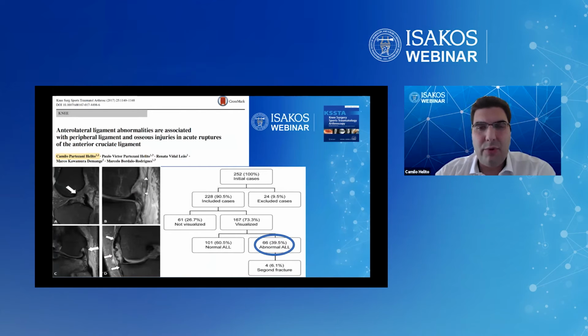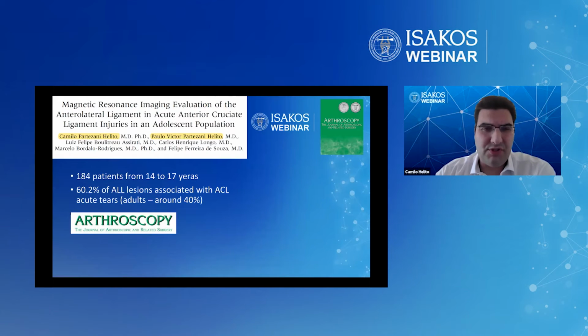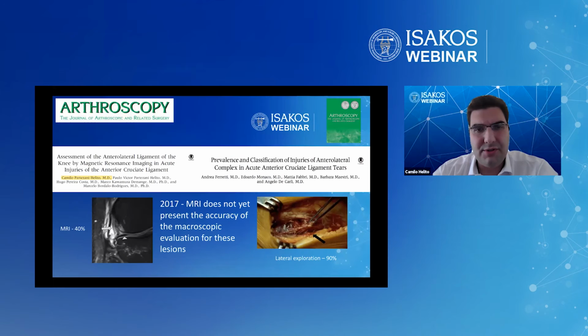But at that time, we could only identify the abnormal ALL in MRI in around 40% of acute ACL tears. This was in adults, and we did that for adolescent patients from 14 to 17, and we could find around 60% of ACL tears. So when I presented that in Shanghai at the ISAKOS Congress in 2017, I said that MRI does not yet present the accuracy of the macroscopic evaluation for these anterolateral lesions.